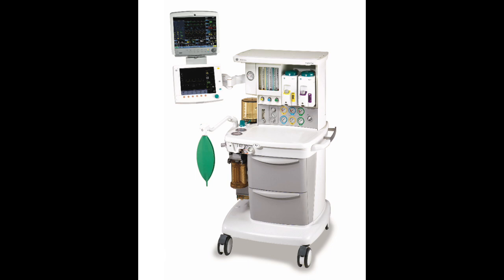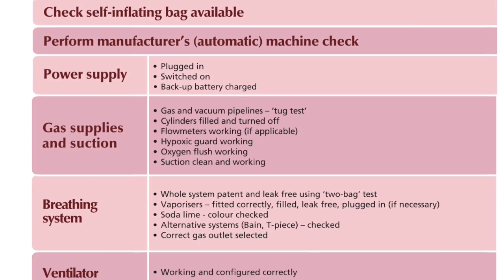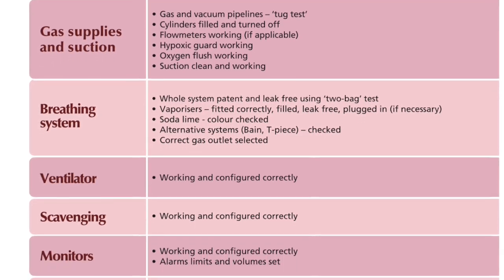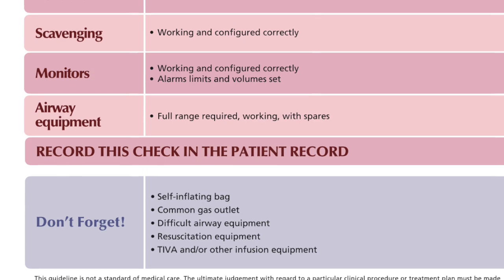In this video we're going to be looking at how to check an anaesthetic machine. The machine that we're using is a Datex Aspire, but the techniques are universal and can be applied to any anaesthetic machine that requires a manual test. These checks are based on the AAGBI safety guideline called Checking Anaesthetic Equipment 2012, which can be found on the associationofanesthetists.org website.